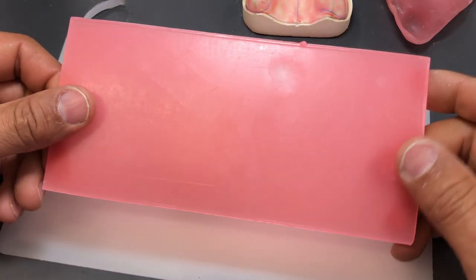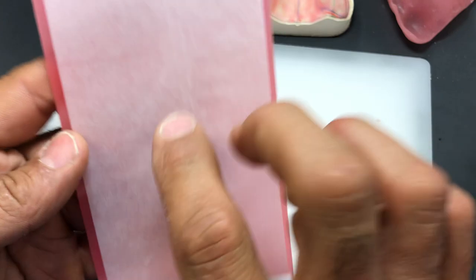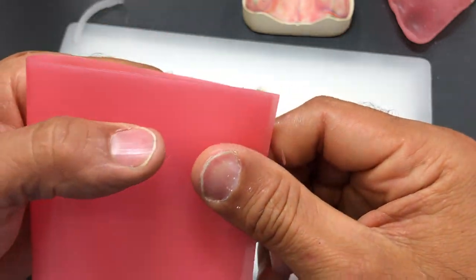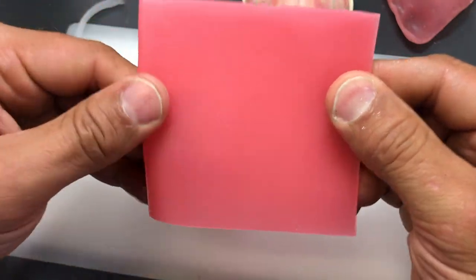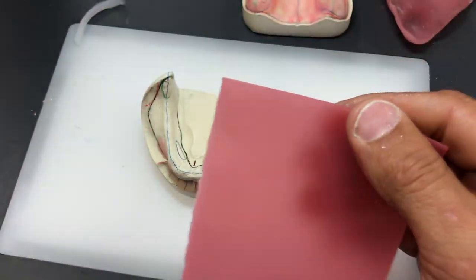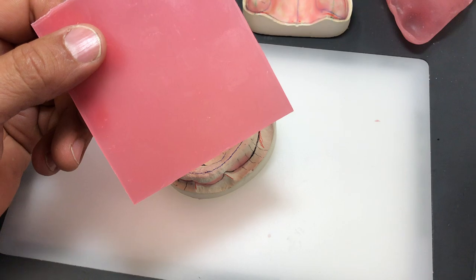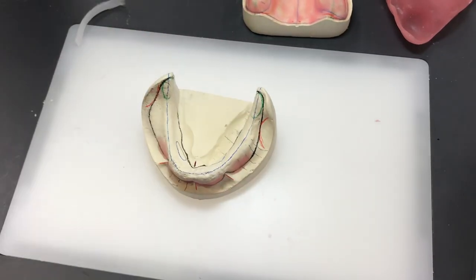So I have a full sheet of base plate wax here. I don't need all this wax, so I'm just going to divide this wax into two halves, pinch it together. I just need half a sheet. So very gently, you're going to apply heat over your Bunsen burner, and we're going to adapt this wax and cut it back to the line.